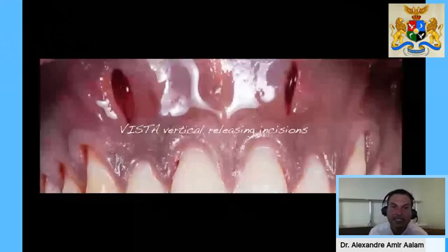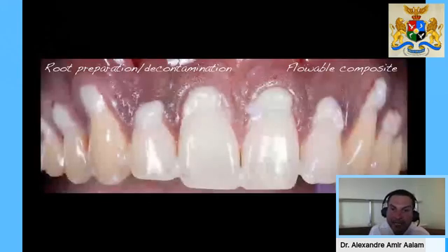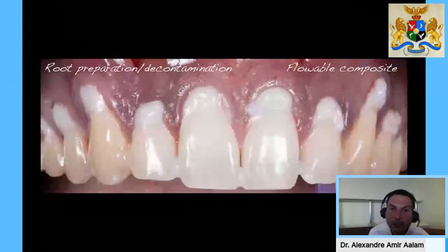So this is an incision that allowed us to make an incision into the tissues, allowing us to have a horizontal preparation. And again, I'm sorry to not be able to show you the video here, but it allowed us to have a very, very passive flap relaxation and have the vascularity of the flap maintained because the tip of the papillas were not released, and having very, very minimal incisions done into the tissue, allowing us as well to create pouches in which we are able to pack the PRF underneath there and suture them into the roots very passively. So what we did as well, not only did we have to modify the incision design, but we had to as well modify the suturing technique.